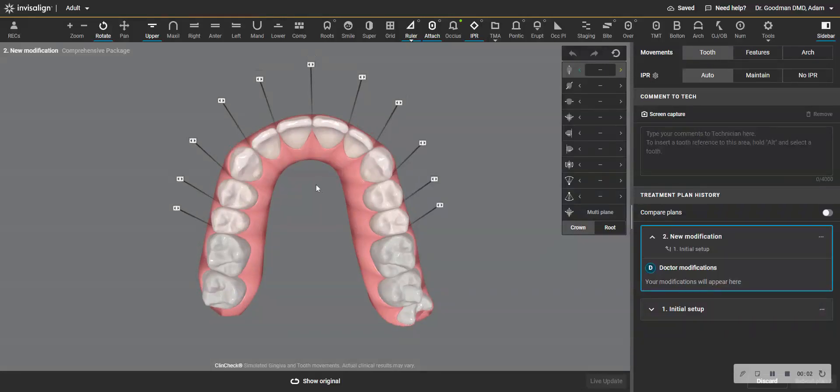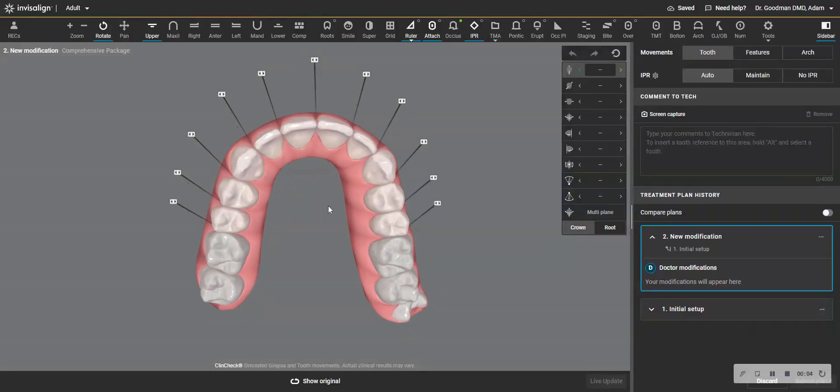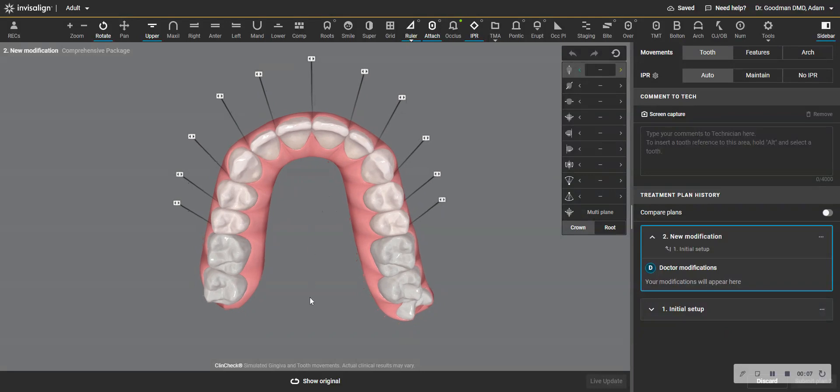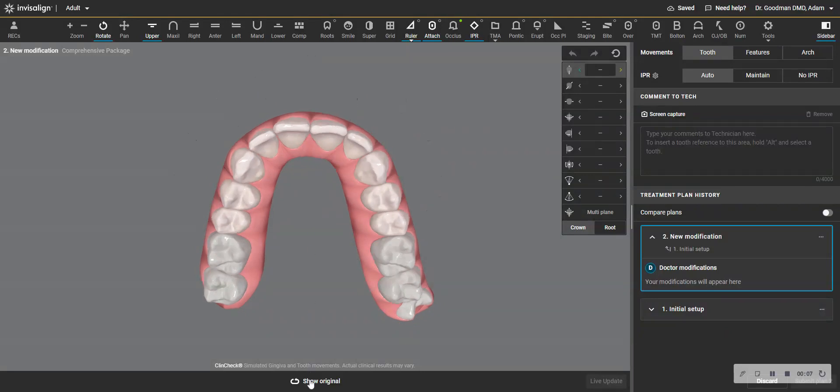Hey, I want to show you a tip that you can use in your cases to make things more predictable. Now, I'm not going to go over the whole case. This is where we're starting.